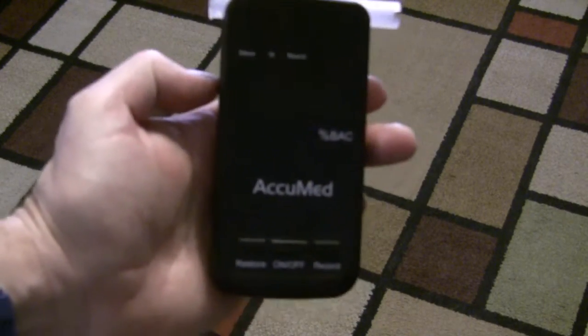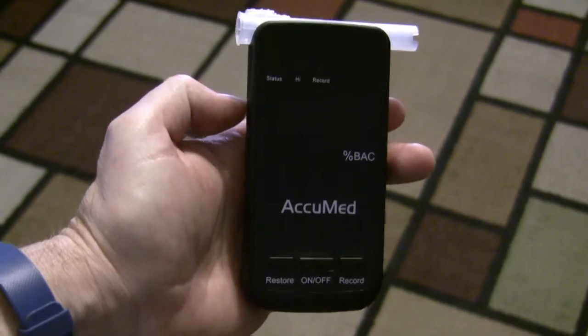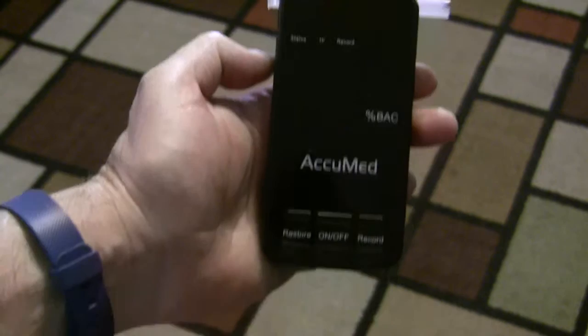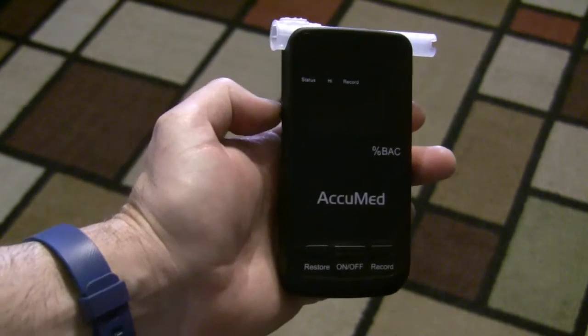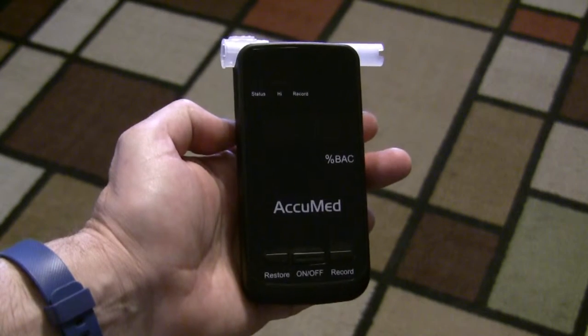I'm reviewing the AcuMed Professional Fuel Cell Sensor Alcohol Breath Tester. This is like the same one that the police use, the same one that drug testing agencies and stuff use.